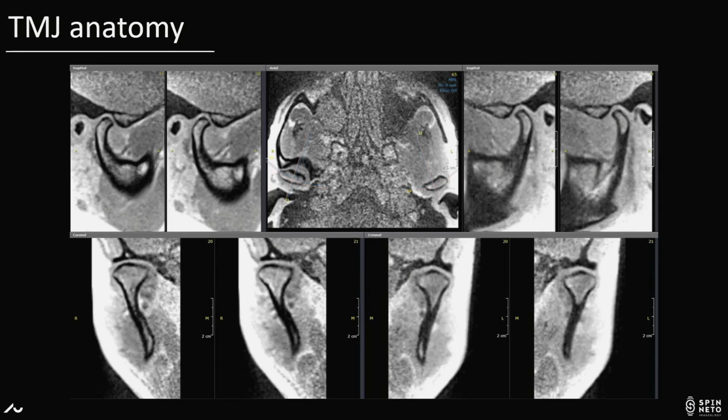What you're looking at here are ultra-short T2 images. It's called a UTE pulse sequence. And what you're seeing is the bone is dark because there's very little signal from it. And in this pulse sequence, it makes a soft tissue really flat. So you can't see the disc. You can't distinguish it from its other areas. And so this is in its native form as it comes off.